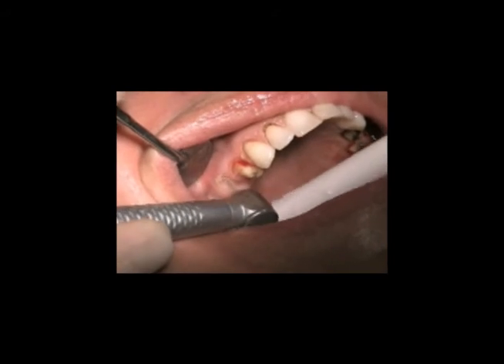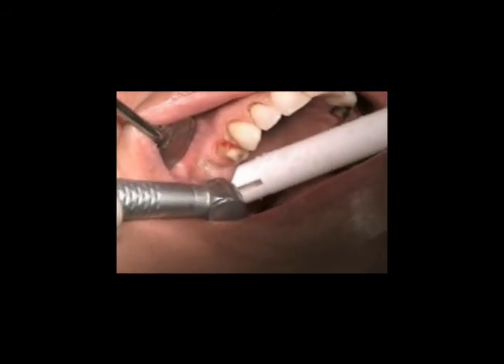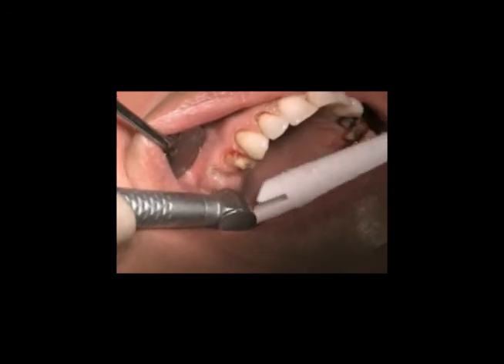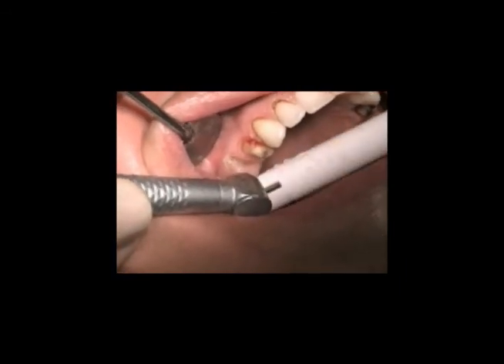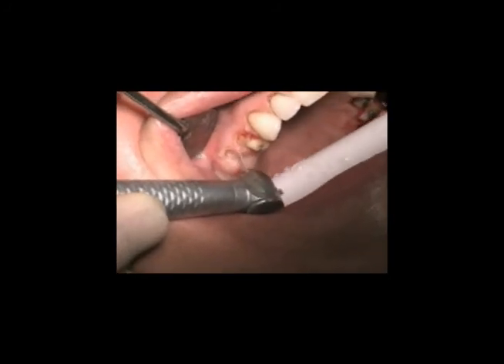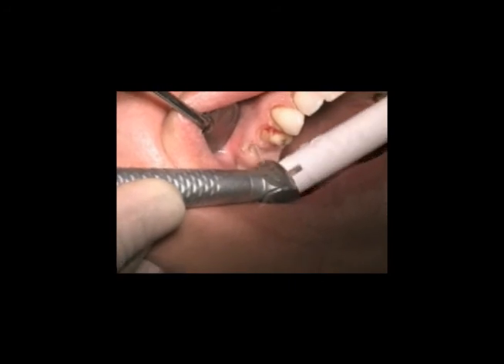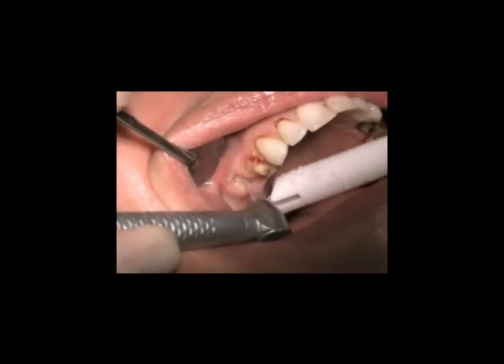The healing with the Erbium Chromium laser, as with the diode laser, is uneventful — virtually pain free with no inflammatory response. The laser paradigm of healing is something that the clinician has to experience, and there is a learning curve so that they know what it is supposed to look like.